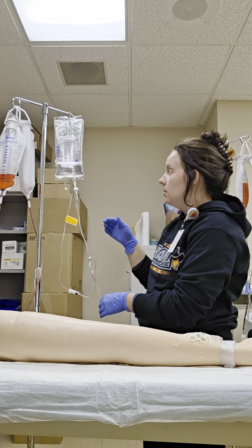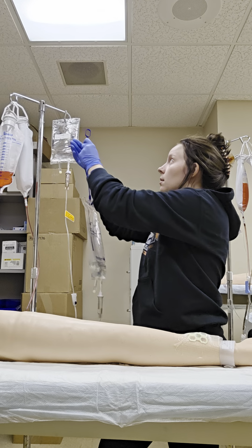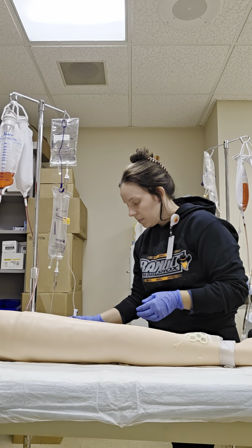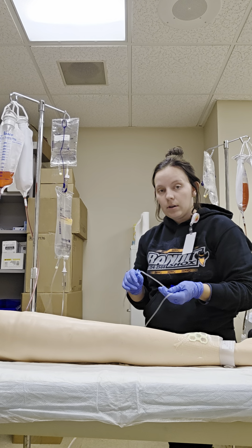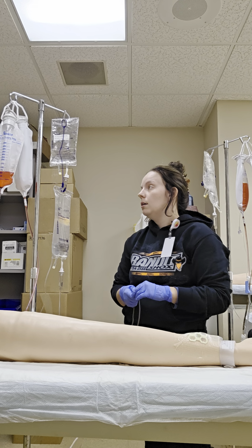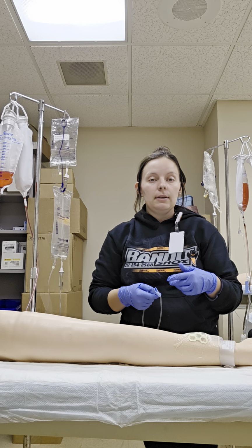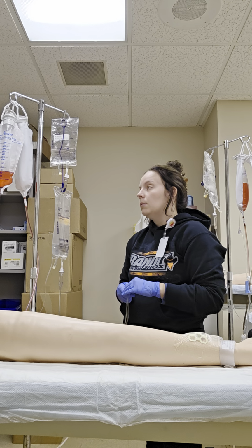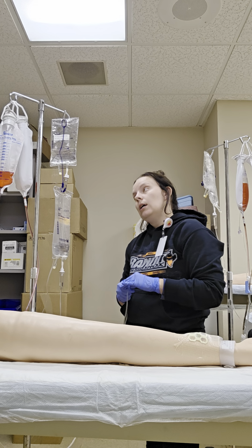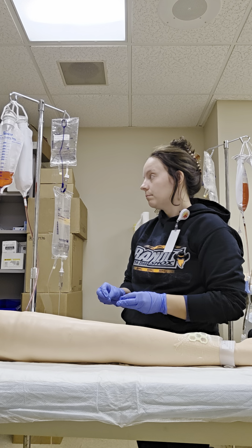So that's connected. So now I'm going to go ahead, lower my primary bag here with my hook. I'm going to open my clamp on my secondary tubing. So clamp is open. I'm going to take my clamp on my primary bag, and I'm going to set my drip right here for my piggyback. So per my calculations, Mr. Foley's going to be receiving 33 drops a minute. So I'm going to go ahead and use the second hand on the clock to set my drip rate to 33 drops. And drip rate is set to 33 drops a minute, excuse me.